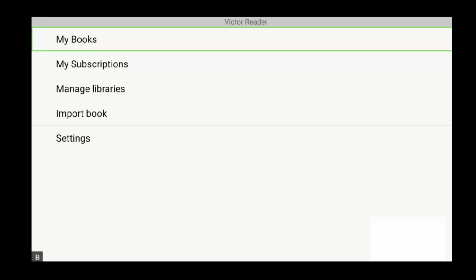The last one is, and this is why we're calling it a preview, the last pillar is the spatial alignment or spatial formatting that exists on a piece of Braille paper. And that's one that we are working with our partner Dolphin to implement, and we'll be pushing that last pillar of eBraille out in a future update coming soon. But we wanted to get a sample eBraille file in your hands so you can experience what it's like to at least access a book complete with tactile graphics on a tactile device like the Monarch.